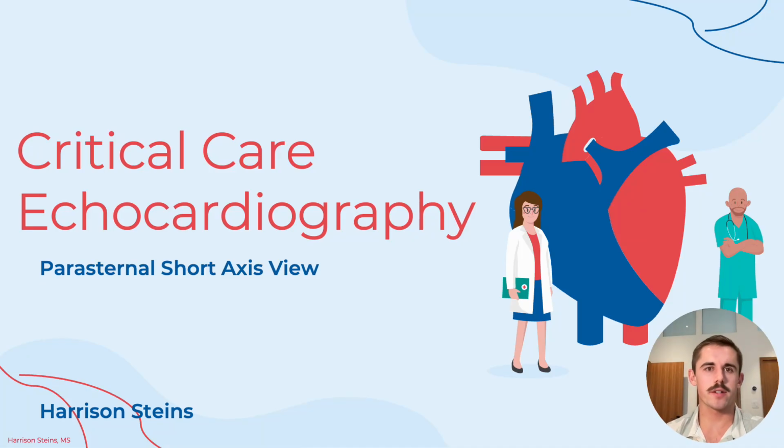Hi, everyone, and welcome back to this installment of Critical Care Echocardiography, especially for the resource limited and austere medical provider. So we went over some measurements, all taken in the parasternal long axis view, and now we're going to move to parasternal short axis view.